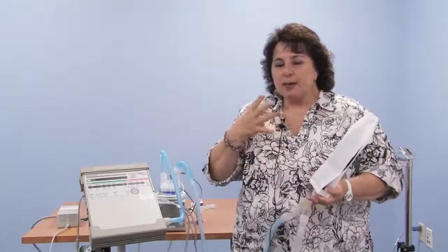And when they go to sleep, they're much more relaxed than when they're awake and trying to play and communicate with you. During those situations, sometimes with the low sensitivity or really easy sensitivity of 1, that air leak out the mouth can make the machine be fooled into thinking that your child wants a breath, and it'll start firing faster. So if you notice a higher than normal respiratory rate, especially during sleep, you will see their chest go up and down, and you will hear the machine fire. You will see the trigger light go off, but it's not your child that's asking for those breaths. It's the machine auto-firing.